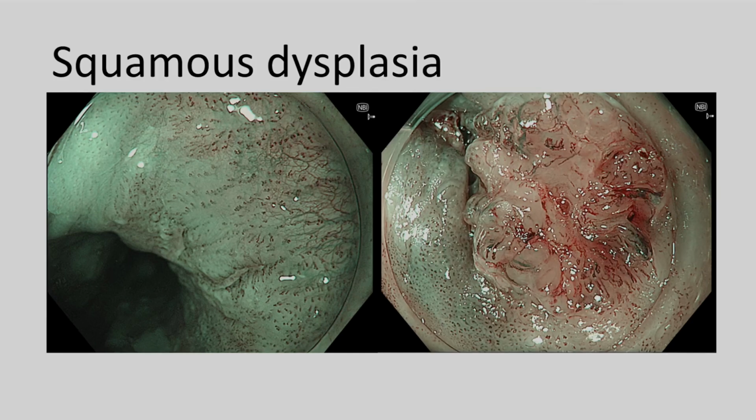So you've got to be really, really careful because the classifications are very clear, B1, B2, B3 types of IPCLs. As it progresses from B1 to B3, the abnormality progresses. On the one hand side, you can see B1/B2, a couple of B2 areas, but in this specimen here there is absolute loss of characteristics within the cancer. This is barn door cancer.